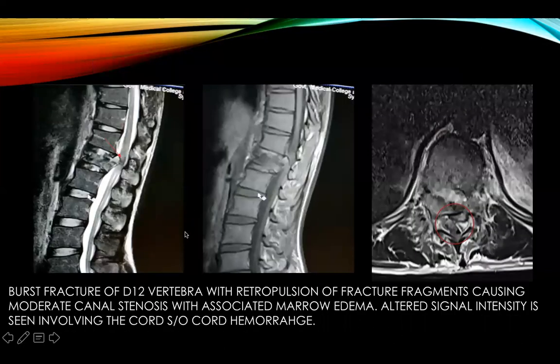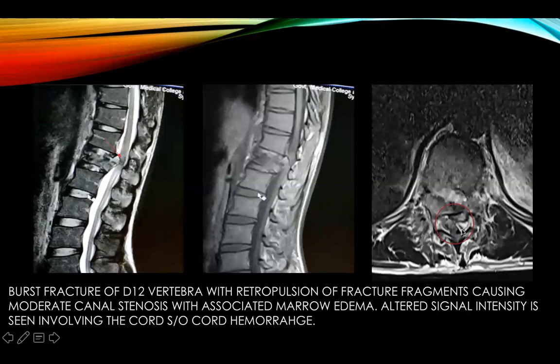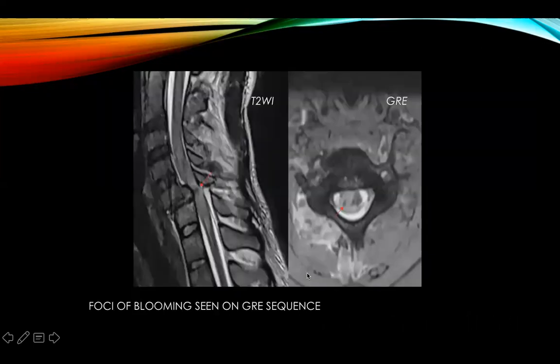This case shows a burst fracture of the D12 vertebra with retropulsion of the fracture fragment causing moderate canal stenosis, clearly visible on the axial image. There is associated marrow edema and a heterogeneous signal intensity within the cord on T2 — hypointensity surrounded by hyperintensity — which is suggestive of cord hemorrhage.